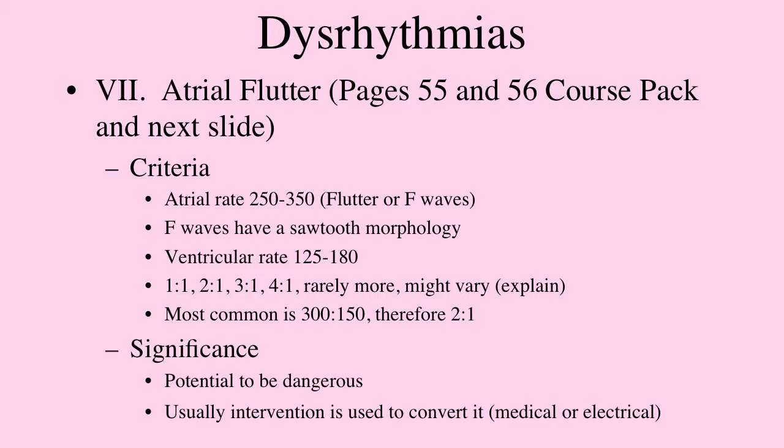Atrial flutter is fairly easy to see as far as the baseline having that sawtooth morphology or flutter waves. And I would be more concerned about just seeing the flutter waves and be less concerned about the exact ratio. Although if you do get the 1-to-1 ratio, you want to be concerned about that. This has the potential to be dangerous.